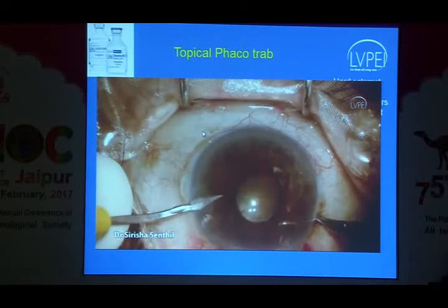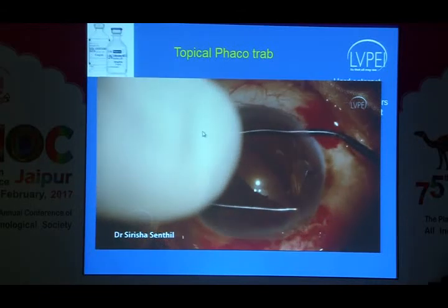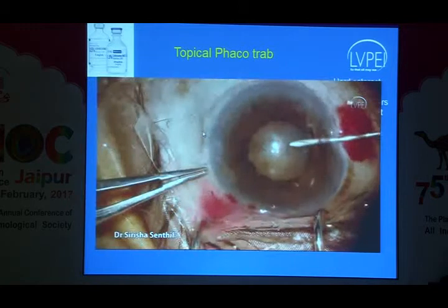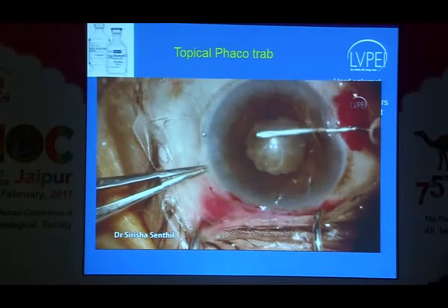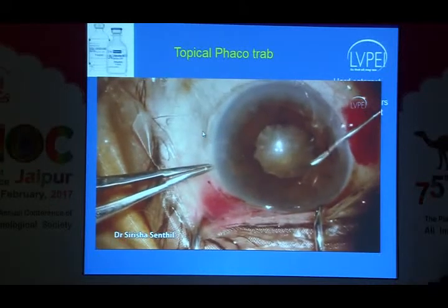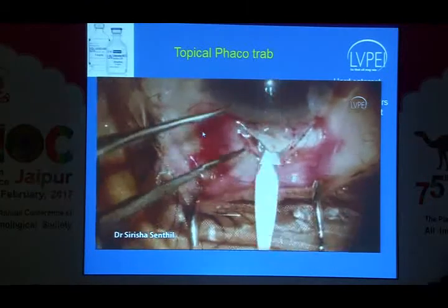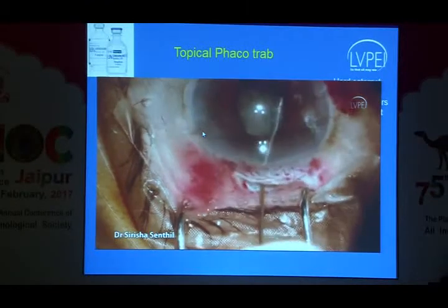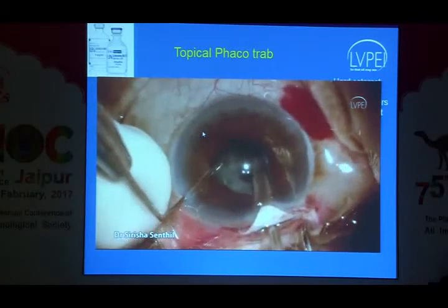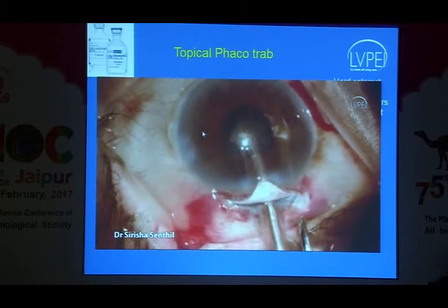So I was just showing you a technique where a small pupil is not a contraindication for a topical phacotrabeculectomy. You can stretch the iris, you can do all of that, provided you use an intracameral anesthetic. What we use has to be preservative-free. Anything inside the eye has to be preservative-free. Lignocaine or Xylocard or ropivacaine, any of these preservative-free agents that we use for intracardiac use, is very safe to use intraocularly. Once you do that, if you stretch the pupil, whatever you do, they are so cooperative, they will actually have no pain. So you can go ahead and do whichever technique you prefer.